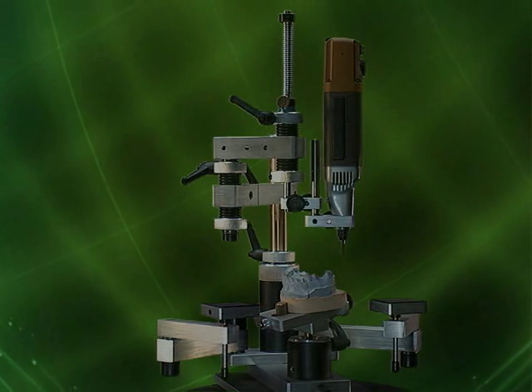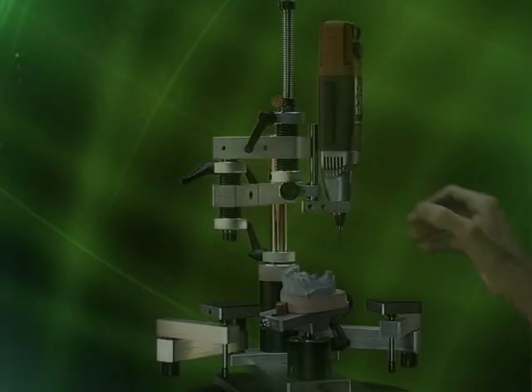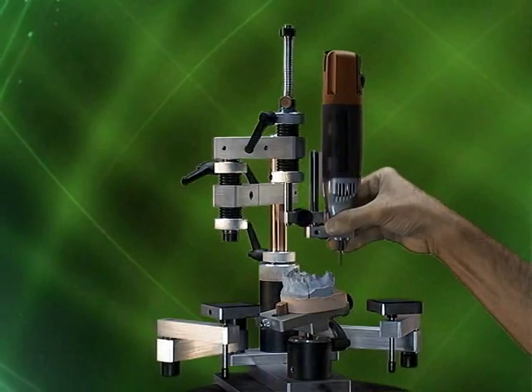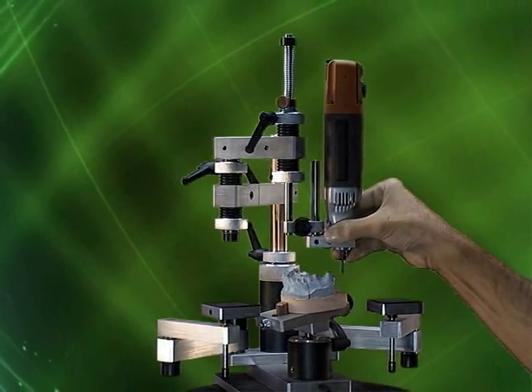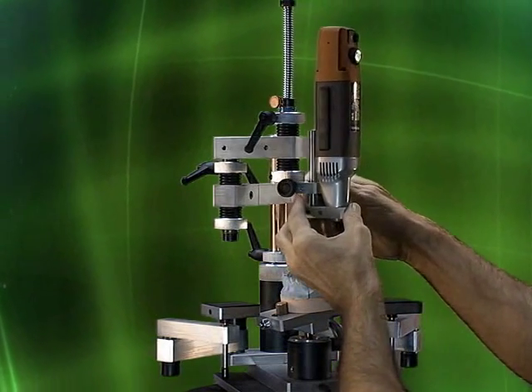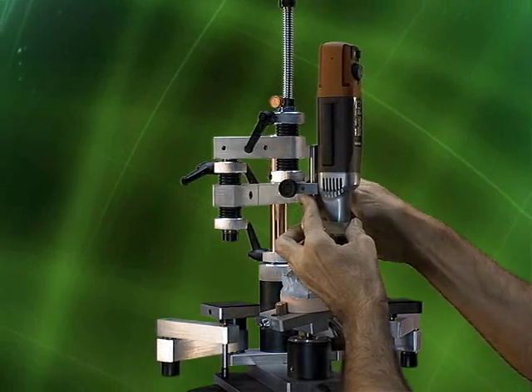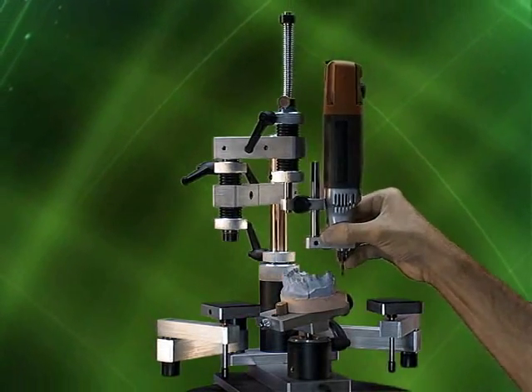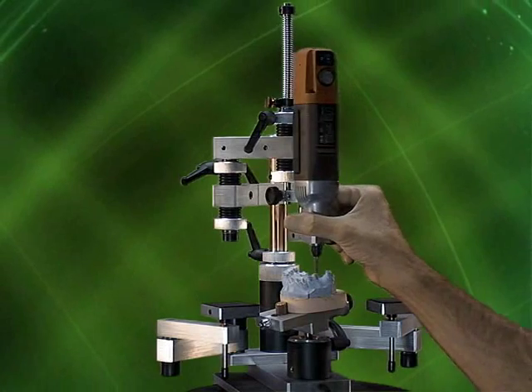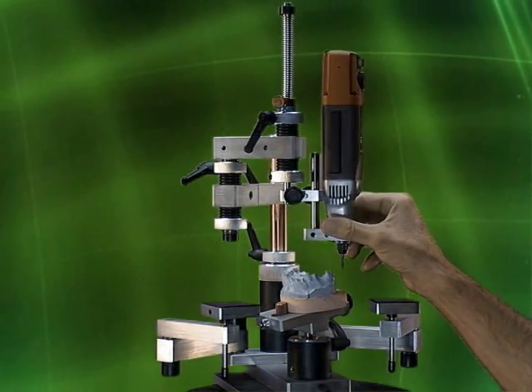Loosen the depth stop screw so the spring becomes functional again. And instead of raising or lowering the primary arm, we just raise or lower the motor arm, so that we can always position our motor in the sweet spot — the ideal working area.